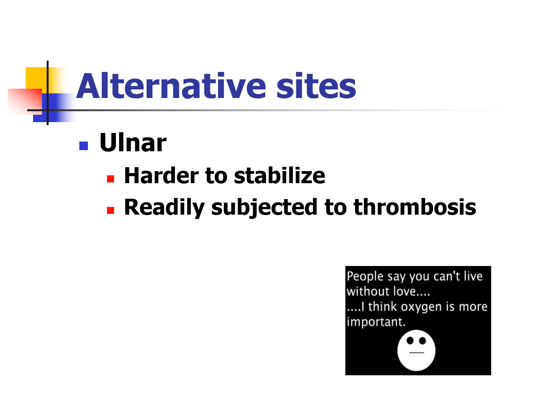Alternative sites: the ulnar in theory is also an alternative site. However, it's much harder to stabilize, it's deeper, and it's more subject to having a clot as part of it. So it's not really something that we would actually use. In my whole practice, I've never had to do an ulnar, even if we could not get a radial or brachial or femoral. That's just not part of our lexicon because there were more risks associated with it.